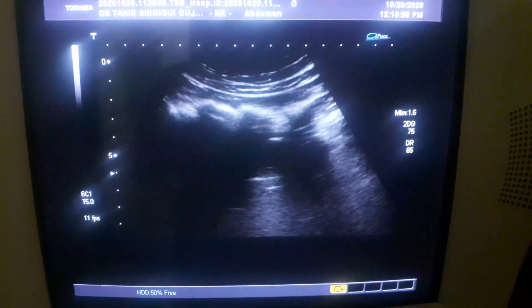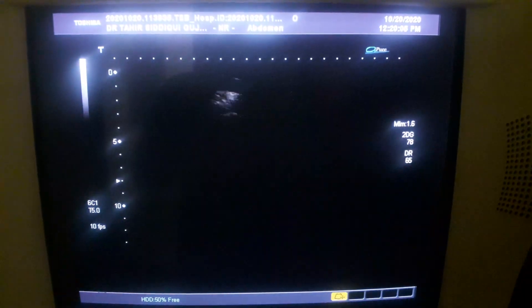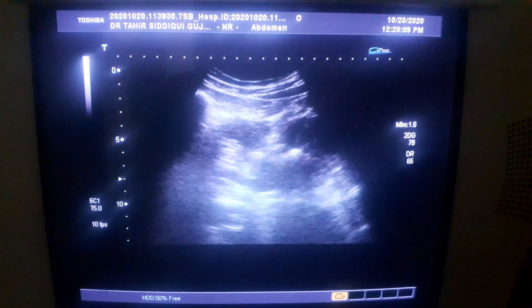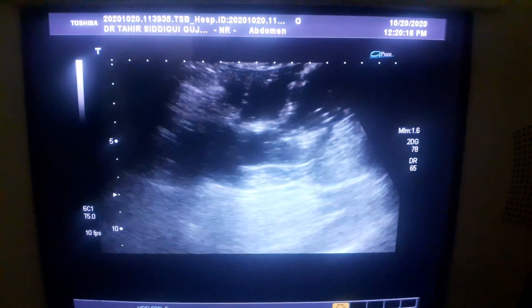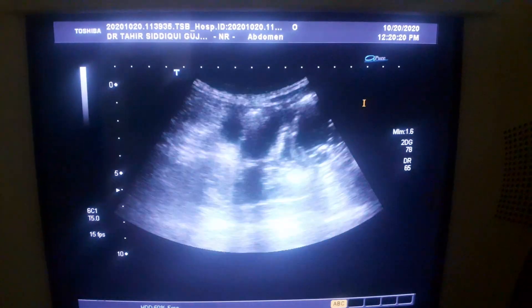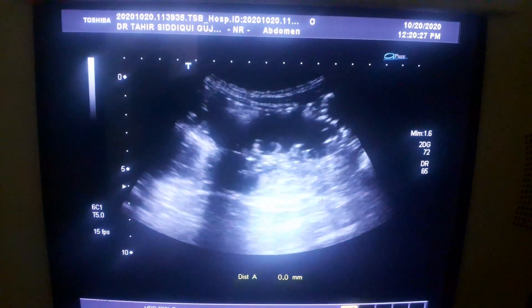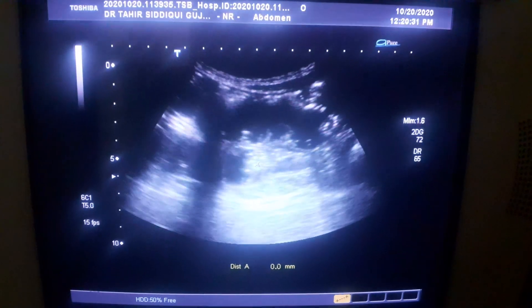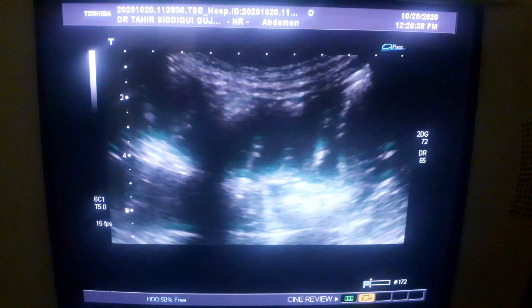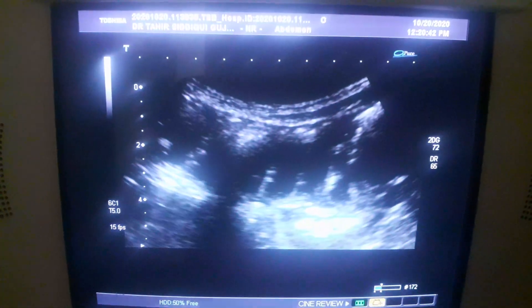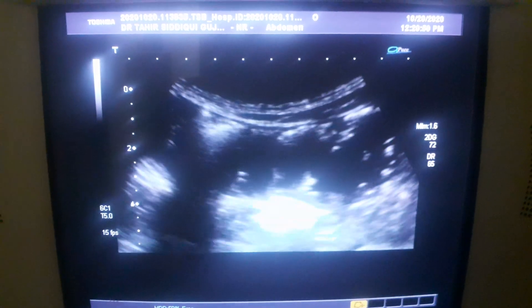Now, as I move the probe towards the left hypochondrium, you see distended bowel segments. This is the iliopsoas muscles, and these are the bowel — distended bowel segments — and you see they show haustra. These are the haustra that you are seeing within the distended bowel.